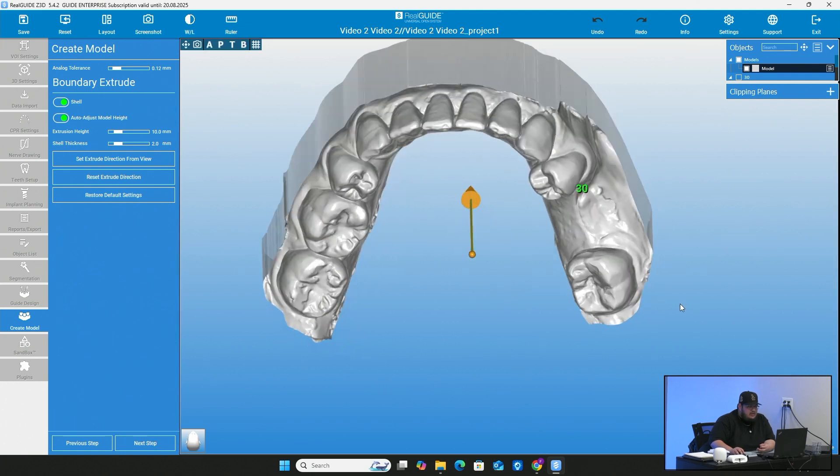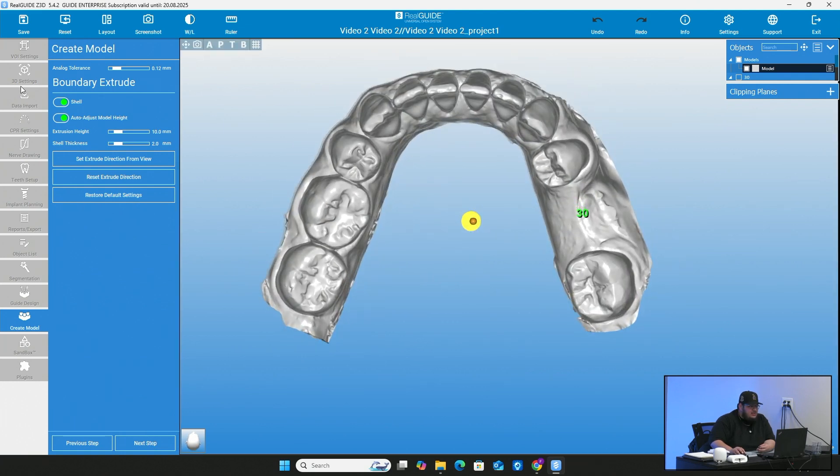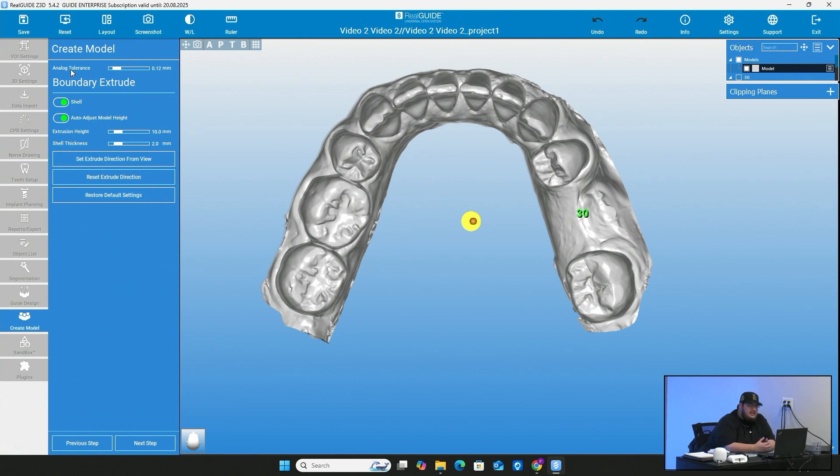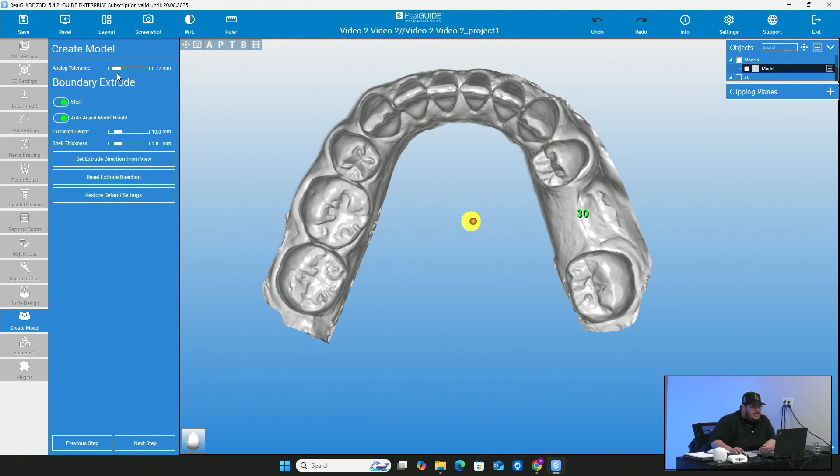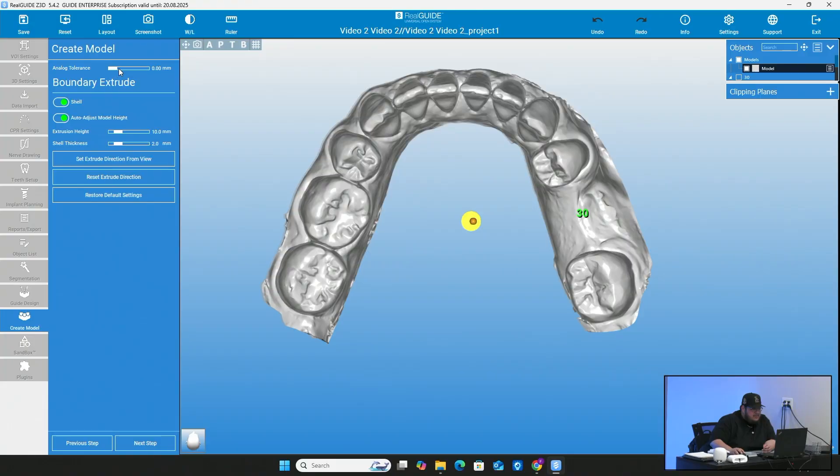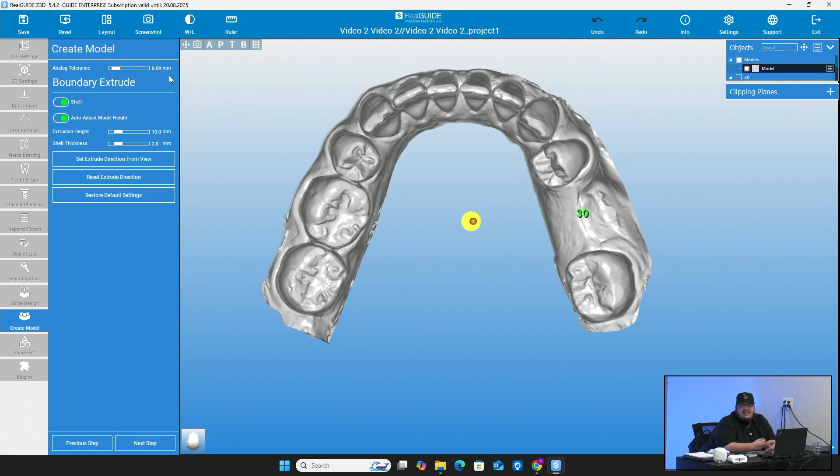And right here, you're going to be met with a couple of settings that you can change. So you have your analog tolerance. So what this is, is this going to be the space of the hole in which you put the analog in. I would say never keep this at zero. Just because sometimes when you keep it at zero, it's such a perfect fit that it does create a hard time actually putting the analog in.